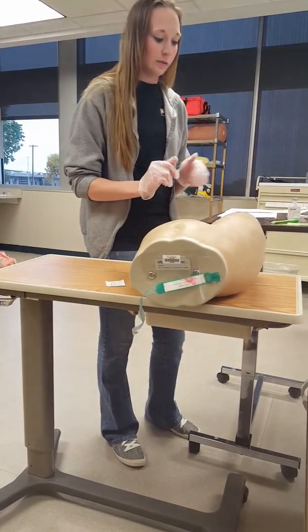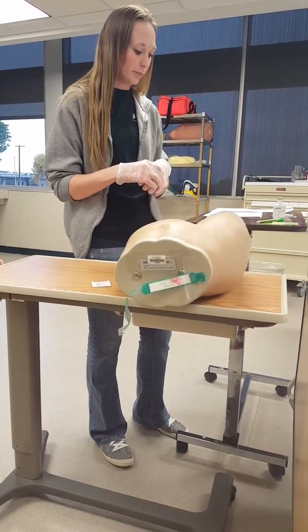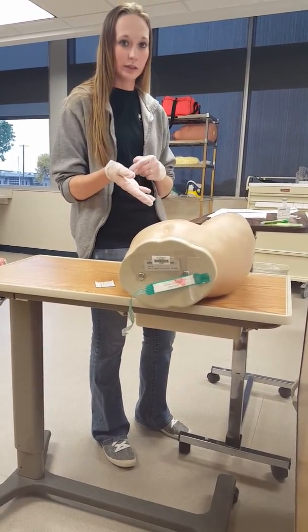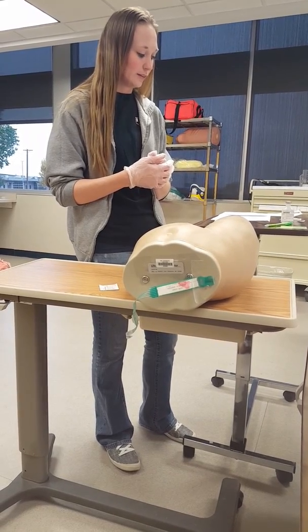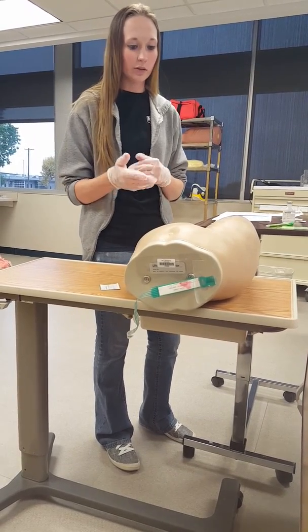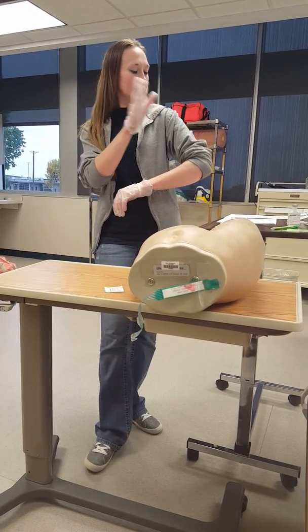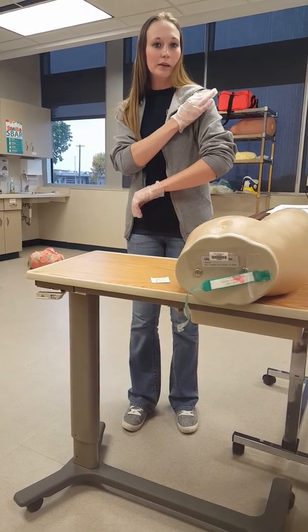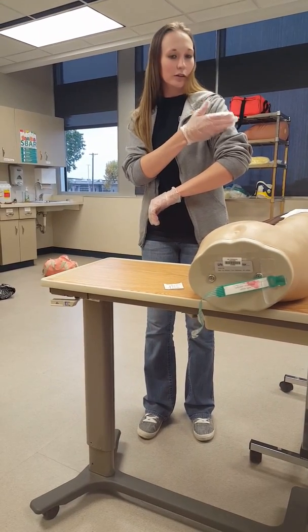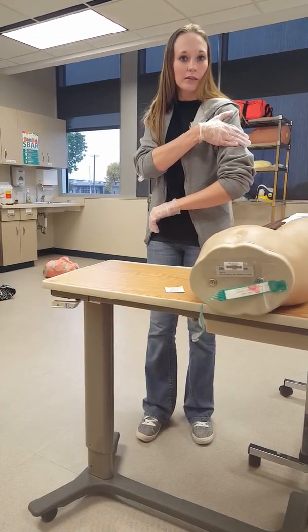And then I'm going to tell you the locations of the parts that you can give this in, and there's 3 different sites that you can give it. The first one is going to be the deltoid, so it's kind of backwards here, but normally your little finger would be up here and your thumb would be down there, so I'm backwards.